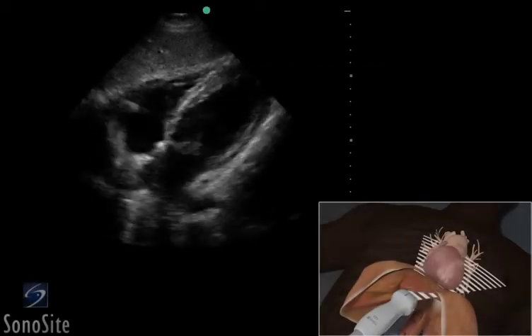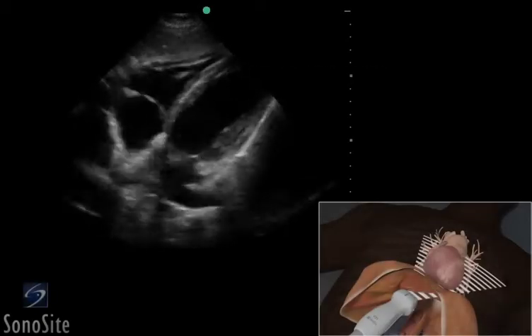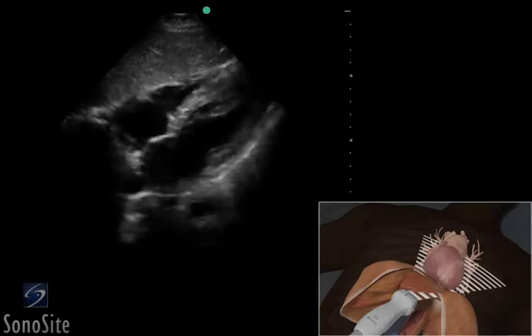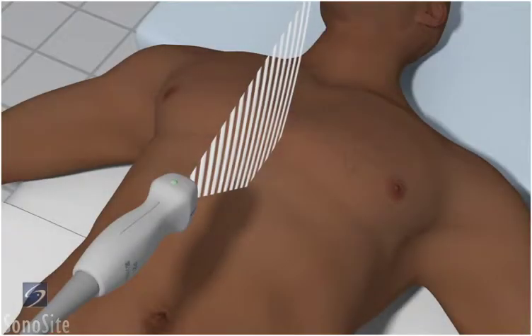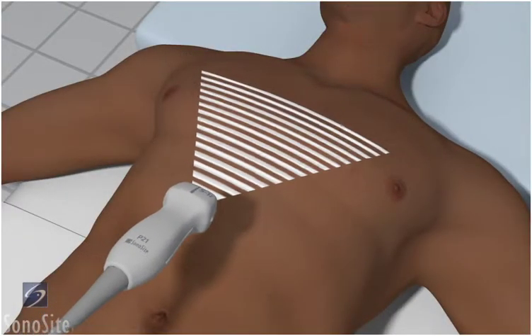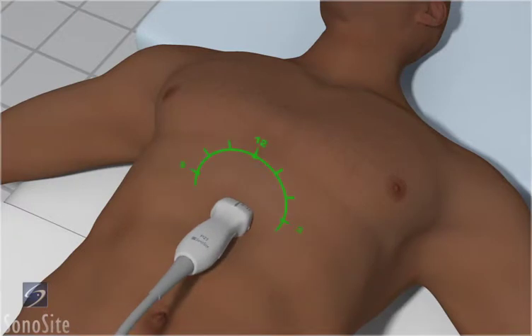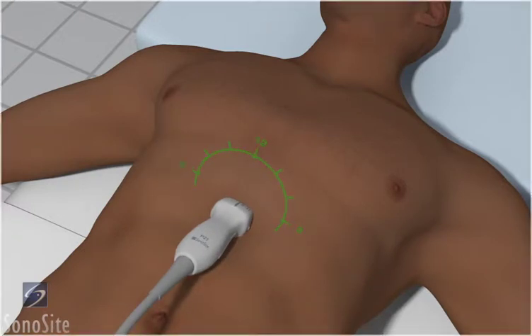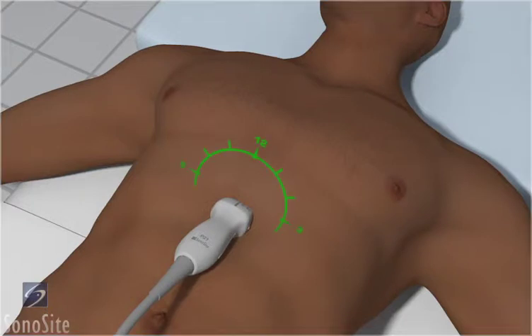A phased array transducer with a cardiac exam type is used to perform the subxiphoid or subcostal view of the heart. Place the transducer in the subxiphoid position with the transducer orientation marker to the patient's left side at the 3 o'clock position. As an alternative approach, this exam may be performed using an abdomen exam type with the orientation marker to the patient's right side at the 9 o'clock position.